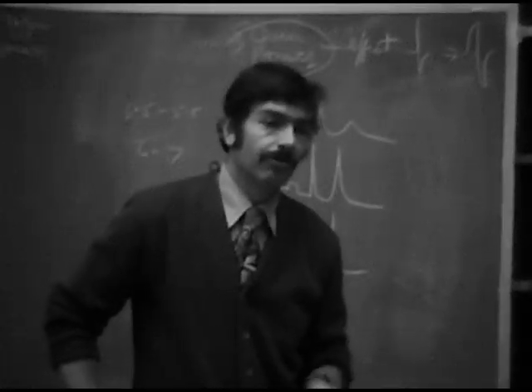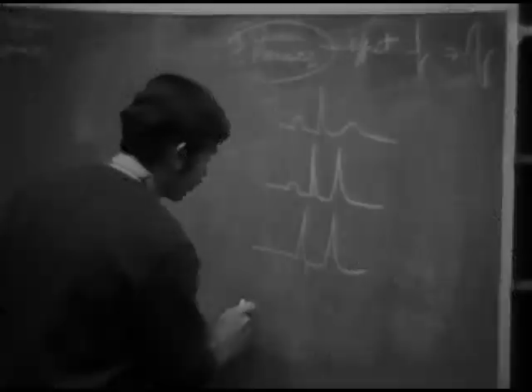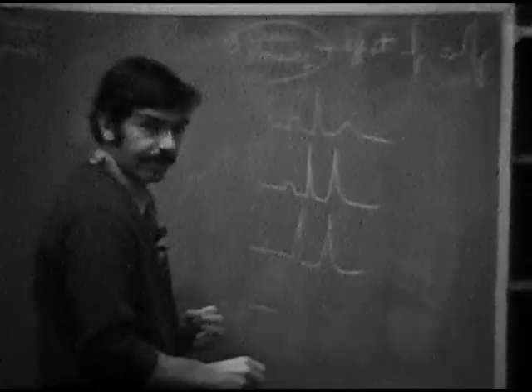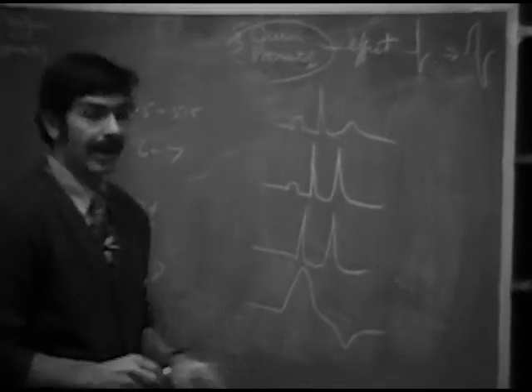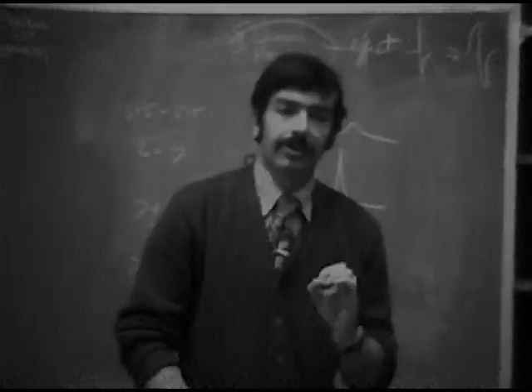Broadening of the QRS, or intraventricular block, again, as we pointed out. And when you see intraventricular block, again, you've lost your P wave very frequently, even though you still have atrial contraction. You'll wind up with a wide QRS, and you may get a secondary T wave change, so you might lose your T wave peaking.